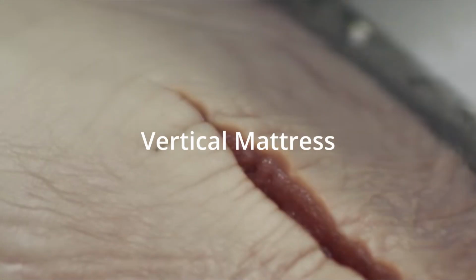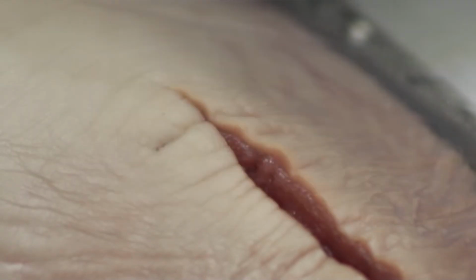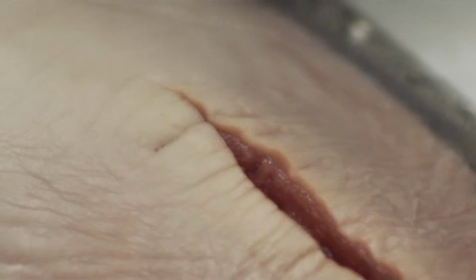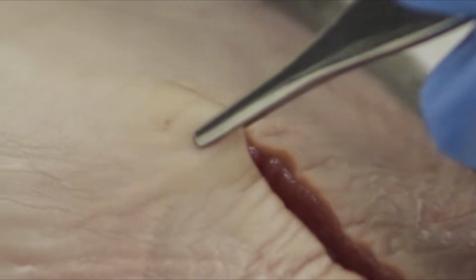Vertical mattress stitch. This is a great pattern when the wound edges need help averting, or when there is moderate tension and a simple interrupted is not quite enough. Setup is the same. Needle driver in the dominant hand and forceps in the other. The driver controls the needle. The forceps gently evert and stabilize the dermal edge.